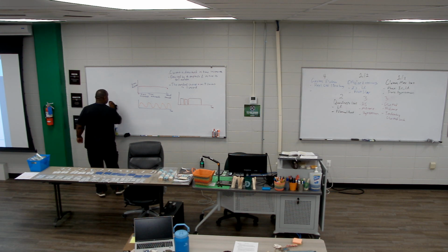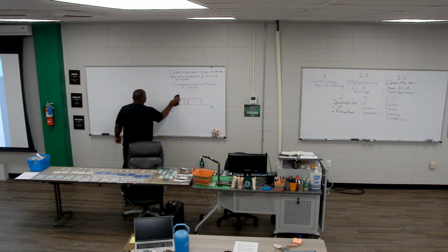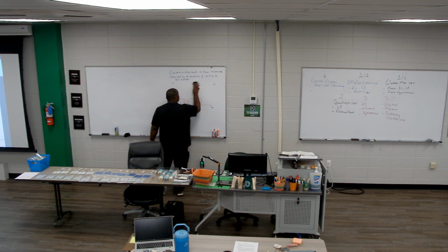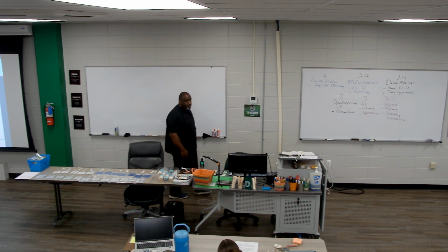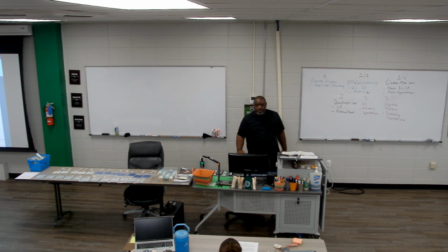All righty. So frequency is how often. Now, frequency is really important. For different techniques, I want my frequency really high, somewhere up around 150 pulses per second or 150 hertz. For other things, I want my frequency really low, 10 pulses per second. We don't really do hertz like that low. So it depends on what my treatment goal is for my patient.